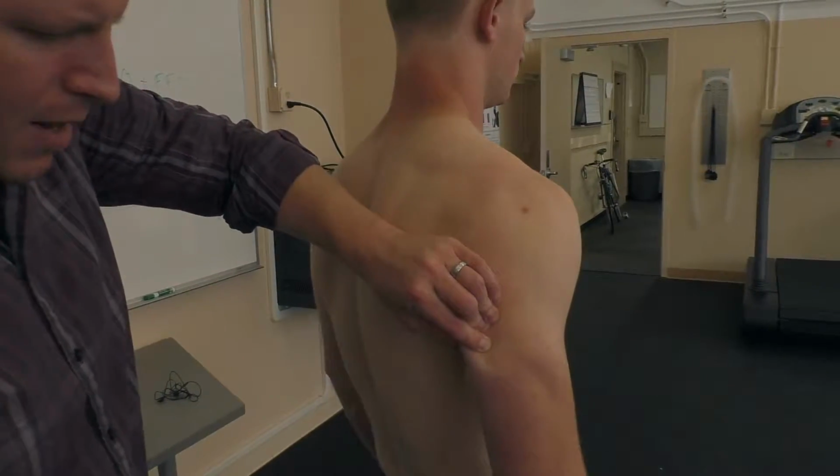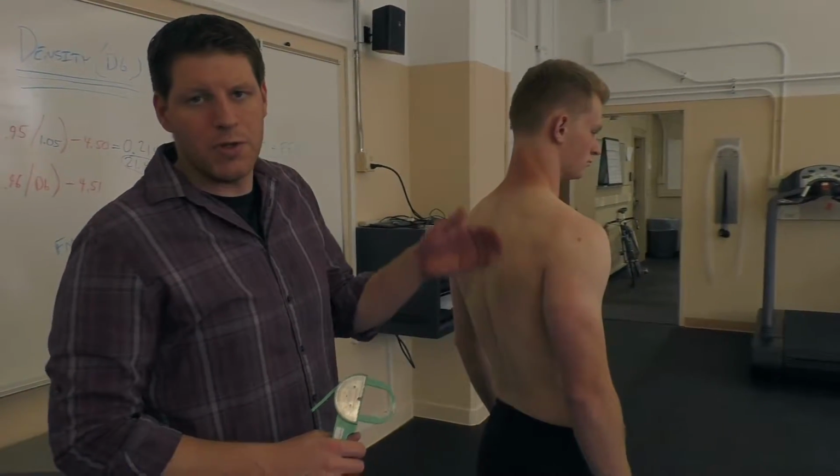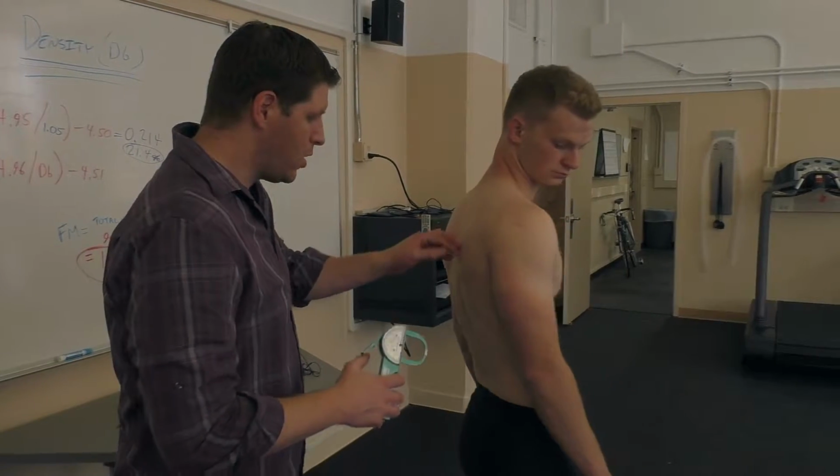Once you have that pinch, you bring in the calipers, and that's 8. And by the way, the abdominal and the tricep, as you saw, are vertical folds going up and down, whereas the chest was a diagonal fold. Okay, thank you very much.